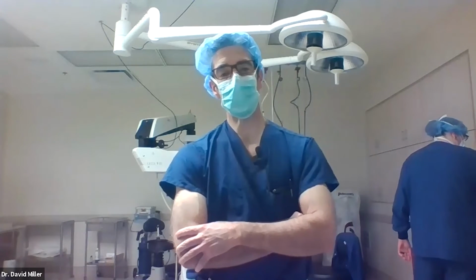We got a nice successful case. So I'm very confident with him leaving the room. I would expect the chance of that working to be 97, 98%. I'm pretty sure we're in good shape. The one thing about small retinal tears is that the success rate is very high as long as you can find the tear. The bigger tears can have more complications, like true PVR. This should not be a PVR case whatsoever.